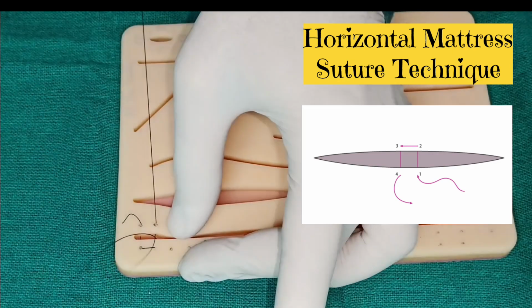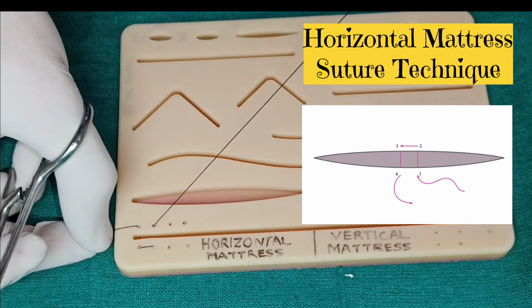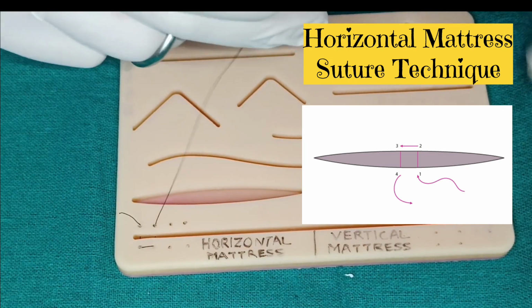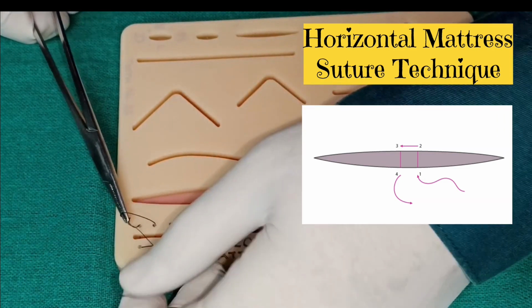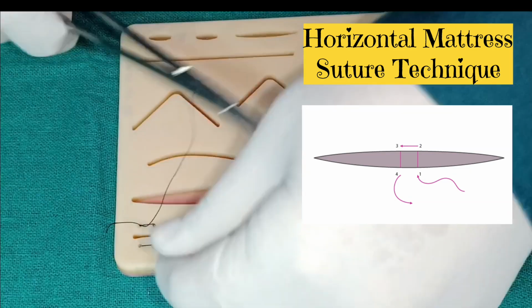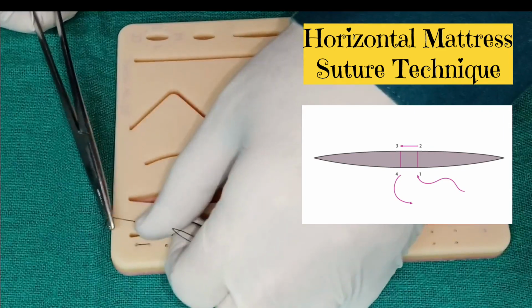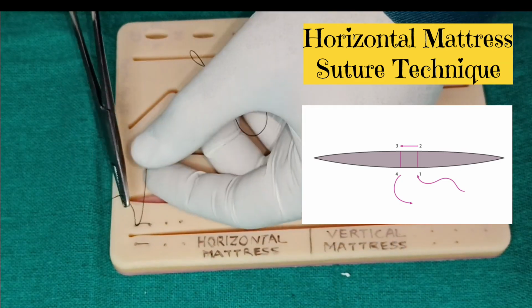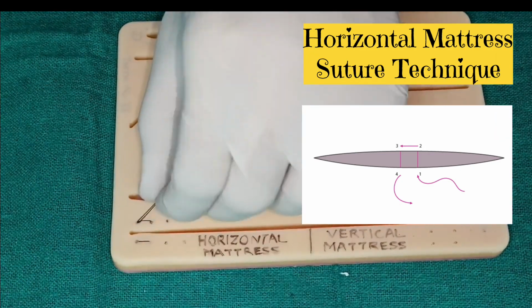Second pass should be identical but parallel to the first pass. Pull gently on the suture ends to achieve wound approximation and epidermal eversion. Tie the suture closed.